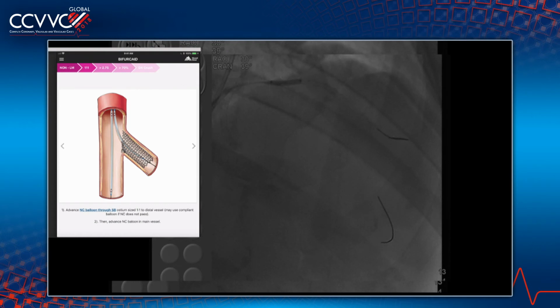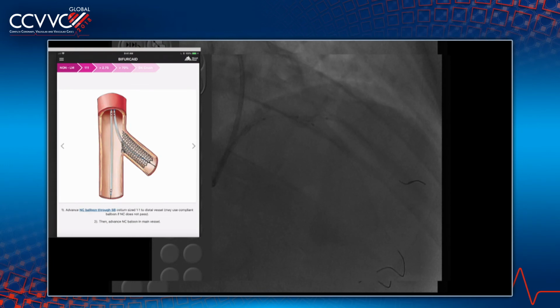One other key point that I want to make: everybody talks about going to the distal strut when you're recrossing and all that. All the data is from the bench study, not from an in vivo study. You can show the slide of the OCT pictures of why you have to go to the distal strut. Everything is a bench study.